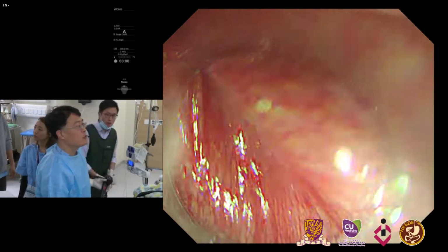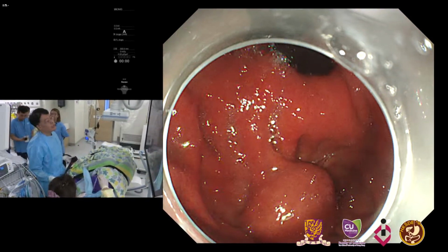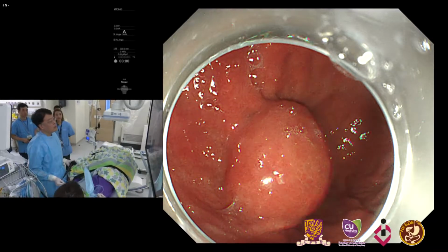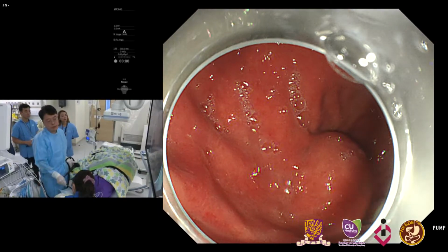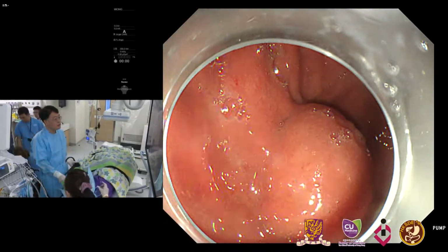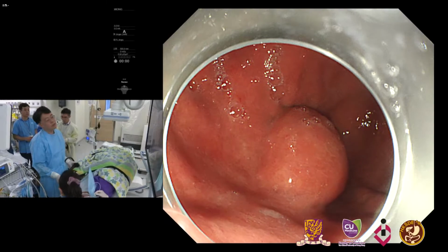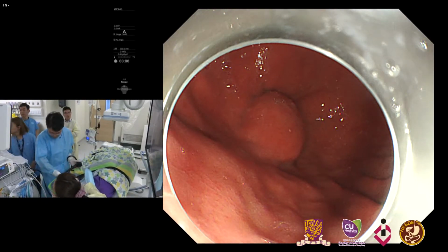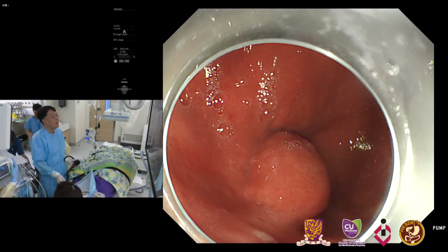This is the esophagus. Posterior fundus. So we could observe the lesion. Just near the fundus, the posterior wall of the fundus, this is a submucosal lesion. The mucosa above the lesion is normal. Water inject, please. It doesn't take effect. So the mucosa is normal, and it is almost totally protruded into the gastric lumen. I think a lesion in this area is almost always a gastrointestinal stromal tumor, and sometimes it is a leiomyoma.